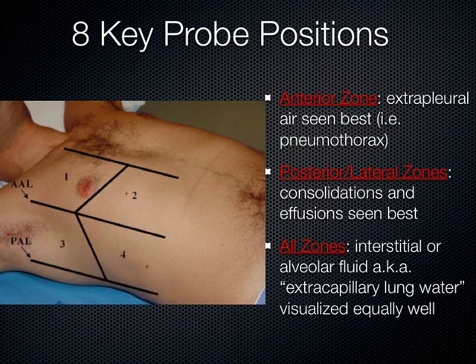And posterior laterally, we can best see effusions, which is fluid that's in the pleural space, and consolidations, which are pneumonias or atelectasis of the lung, posteriorly, because those are gravity dependent. In all zones, though, you can appreciate pulmonary edema. Pulmonary edema in very rare circumstances will be unilateral, but in most cases, this is due to being able to see it in multiple fields.